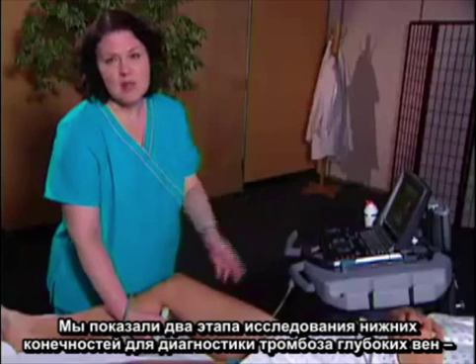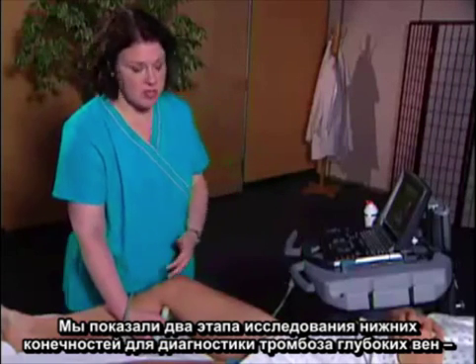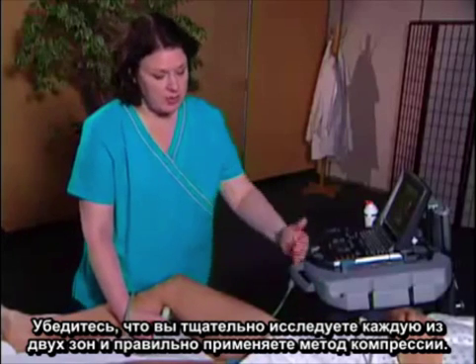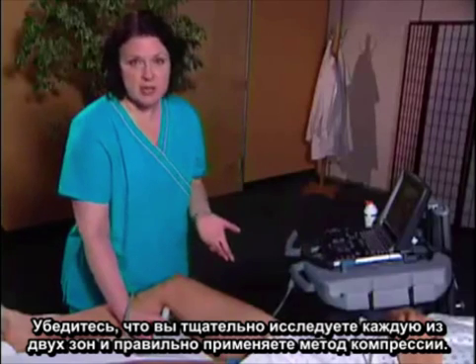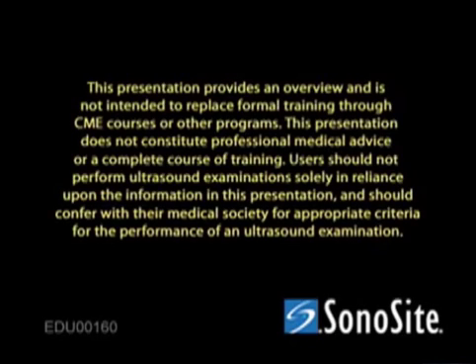Those are the two steps for assessing the leg for deep vein thrombosis — just these two evaluation points. Make sure that you evaluate each area thoroughly and perform your compression technique completely.